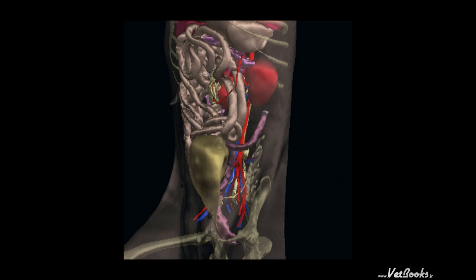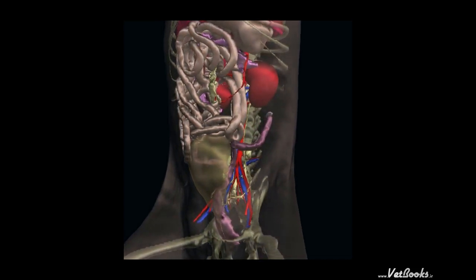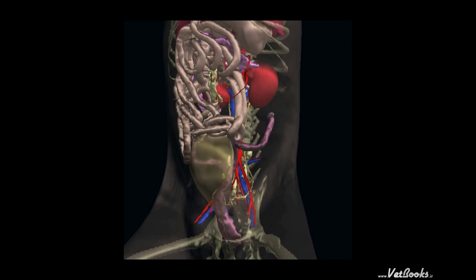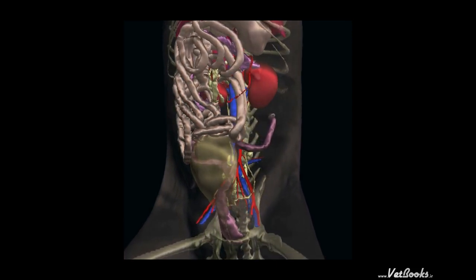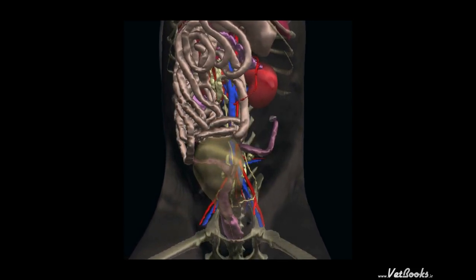Obviously, the size of the reproductive tract will vary depending on the estrus cycle and will be most easily detected during estrus. Note the proximity between the ovaries and kidneys. Identification of the kidneys is a good starting place to locate the ovaries, especially when the uterine horns are not large enough to be identified and followed cranially.